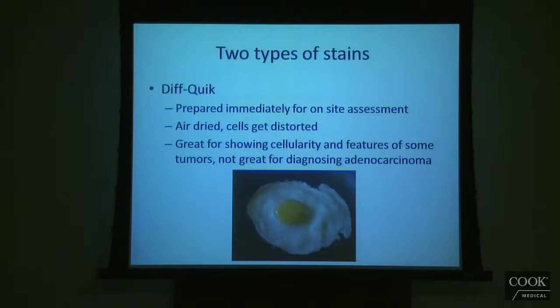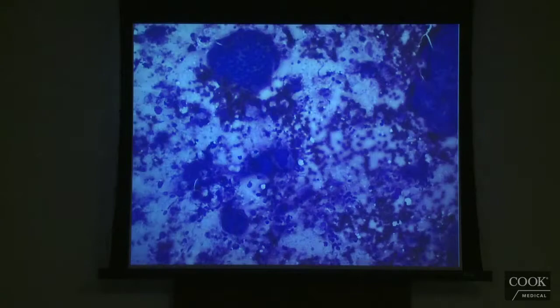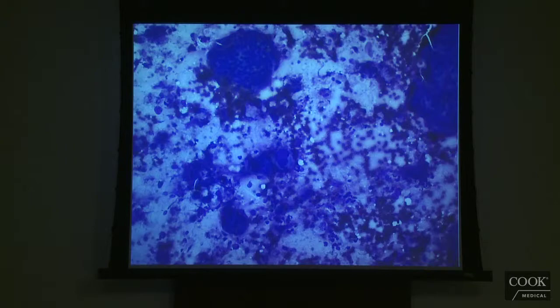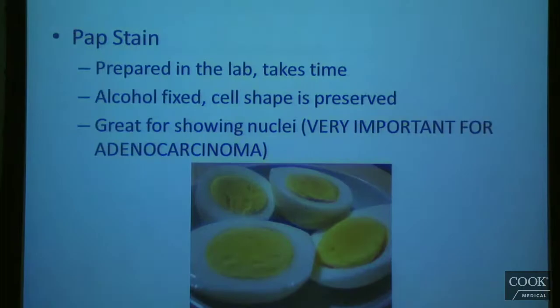The advantage of the diff-quick is that it's really quick and we can get a quick look. The drawback is that even though you can see the cellularity and some features of the tumor very well, the morphology is not great — it's fair to good, but not great. Some detail is sort of lost when you do it this way. You can make the analogy to frying an egg: when we dry these cells out they sort of flatten and blow up. It's still an egg and you can tell it's an egg, but it's not the same round thing you started out with — it's sort of distorted. Here's an example: here's a cancer cell and you can see it's sort of blown up — you can tell it's an abnormal cell, but it's really hard to see the detail of the cell.